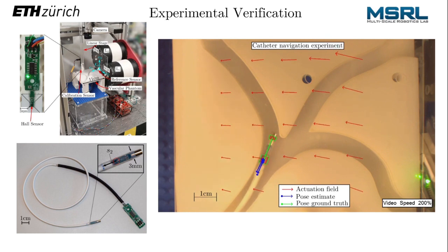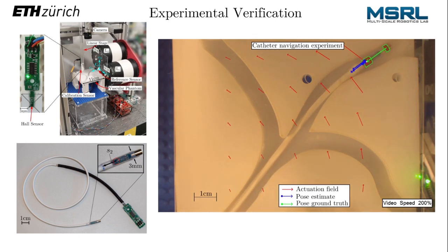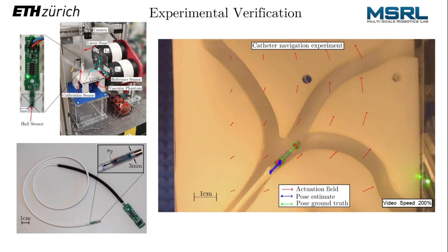By applying an actuation field, the catheter could be directed in a desired direction. Together with the advancement mechanism, this allows for navigating the different branches of the flat vasculature model. Catheter localization was performed at a rate of 10 Hz and the mean localization error in this experiment was below 1 mm. The pose of the catheter within the flat model could be estimated with an accuracy of approximately 1 degree. Actuation was achieved using magnetic fields in the order of 8 millitesla.